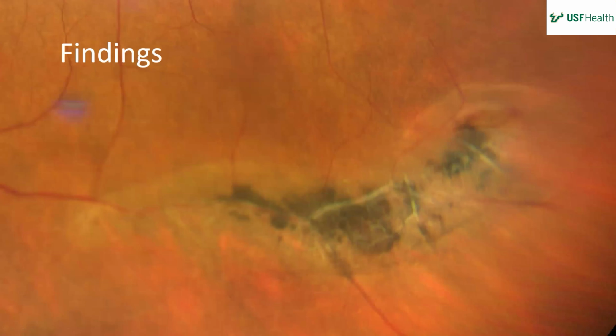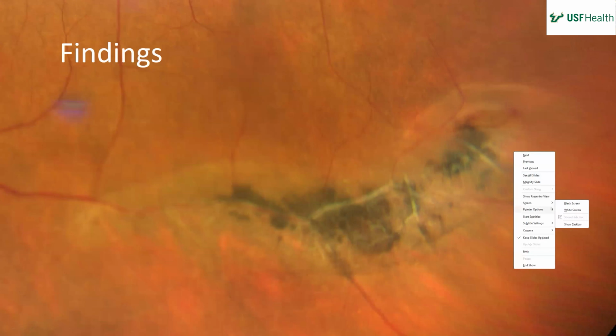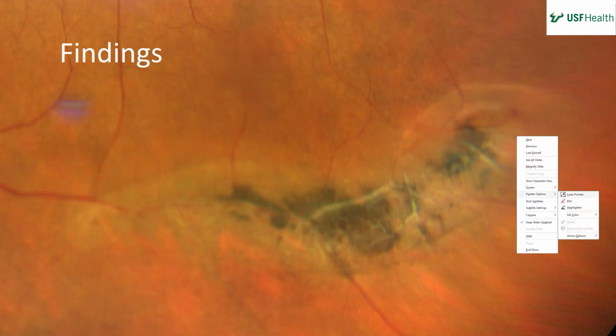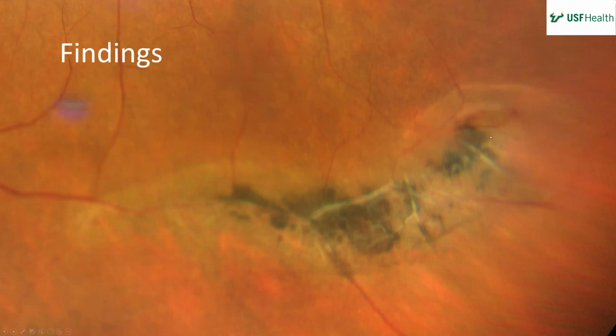So this is a zoomed-in view, more of the same. I do think those correlate. It looks like it's a branch from that vessel, like a ghost vessel. And again, we just see these pigmented patches, maybe surrounding subretinal fluid or just pallor in general. What about right there where it keeps going? Okay, sure. Hence the floaters and the flashes. So maybe a little tear there with some elevation, a little heme.